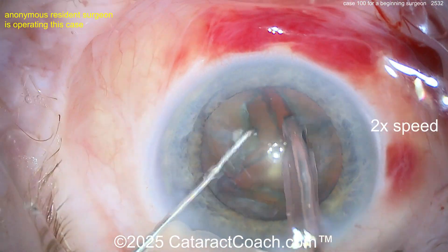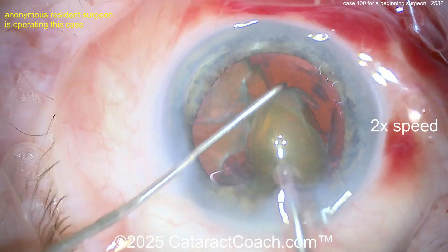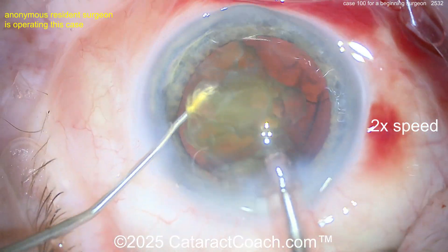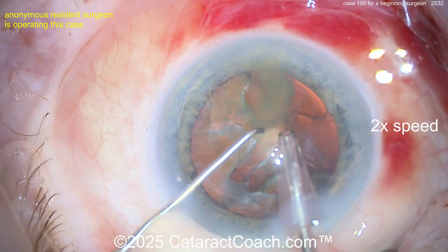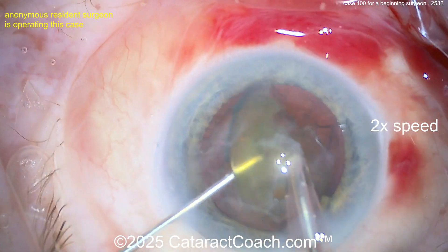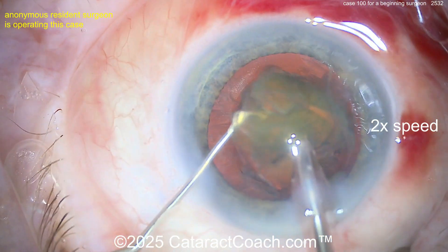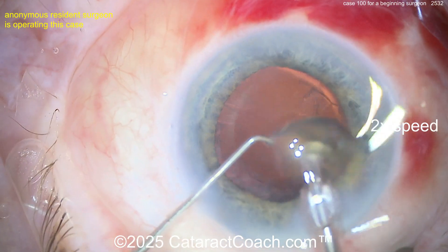Remember your goal is to ultimately graduate to learning all the techniques of nuclear management — not just divide and conquer, but also stop and chop, and then phaco chop both horizontal and vertical. Now nuclear pieces are coming out fast — the video is sped up so it looks super fast, but it's pretty reasonable. Some chopping there — that's a good start to learning how to chop. A little divide and conquer then some kind of mini-chop.